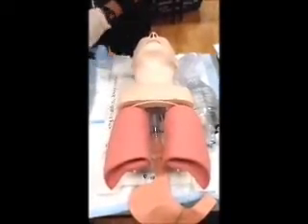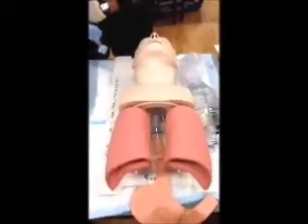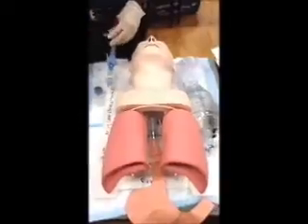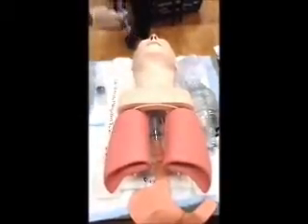Responder confirms that the selected airway is acceptable for use, deflates the cuffs, and applies a water-based lubricant, making certain not to intrude upon the ports. Responder also prepares a secondary airway in case of equipment failure.